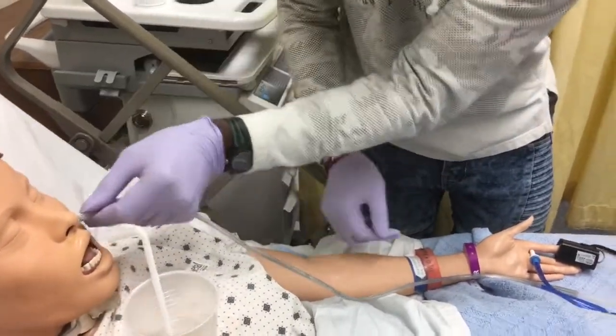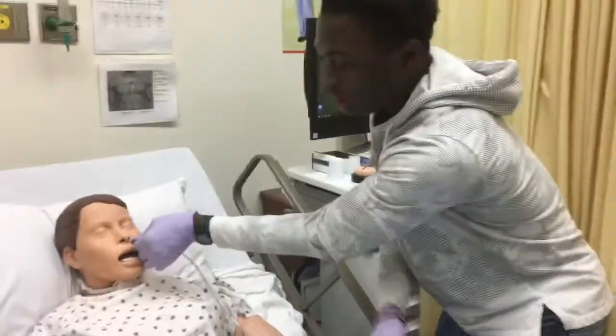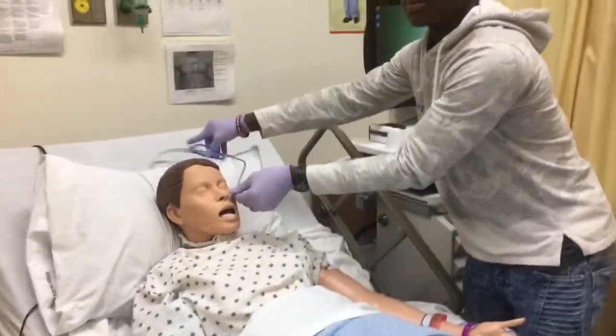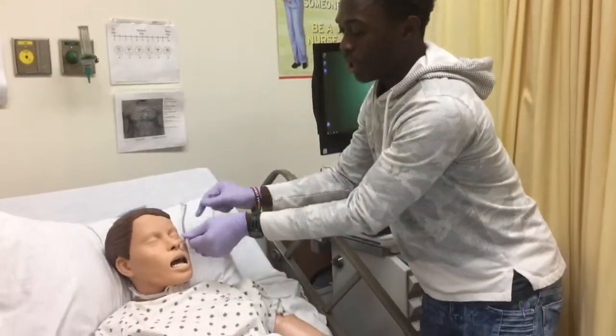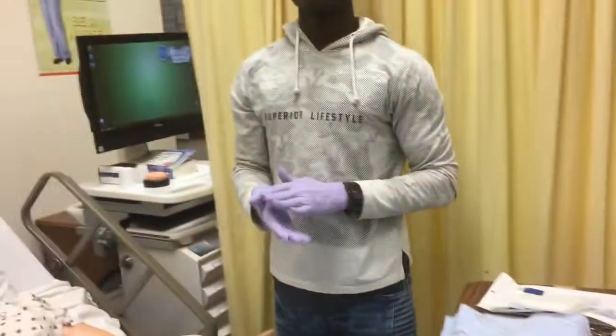Okay, so after you have done that, you can take the water out, and you want to put this up here because now I'm about to check for placement of tubing. So I'm gonna put it over there, and to check for placement of tubing, you can use like three methods.